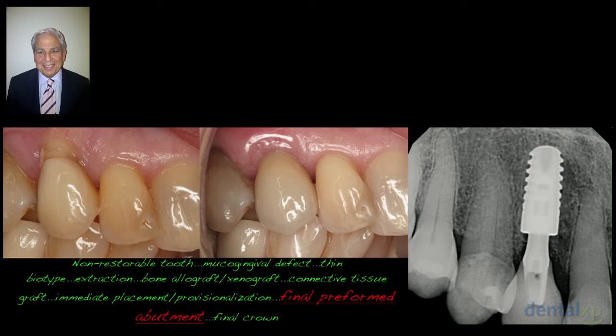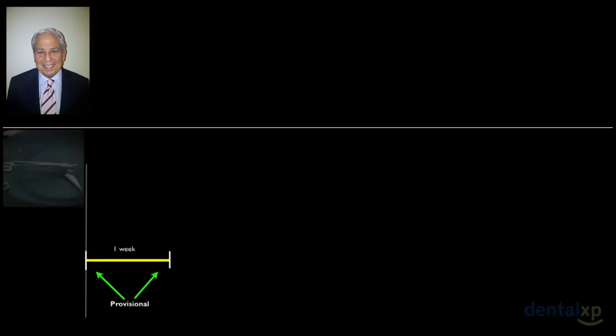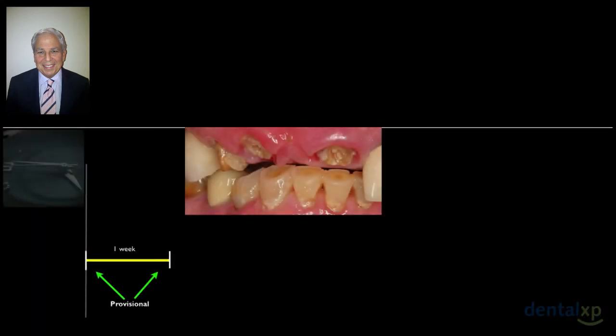The key is that the final preformed abutment was put on at the time of surgery. We use a lot of CAD/CAM abutments in our office. I don't want you to think that I don't. But when we need an abutment immediately, then we have to go with something that is going to be preformed, that is going to work for us. And we'll take a look at a situation that's a little bit more dire.